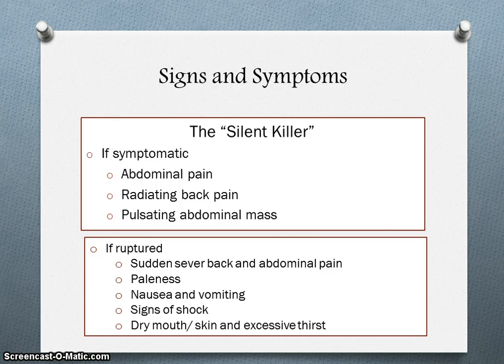This is one of the most important signs to find when you're assessing for an AAA, because if they're not in shock yet, that means there's a better success rate in treating them before they actually lose life.